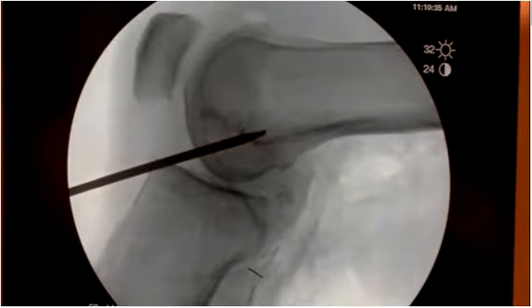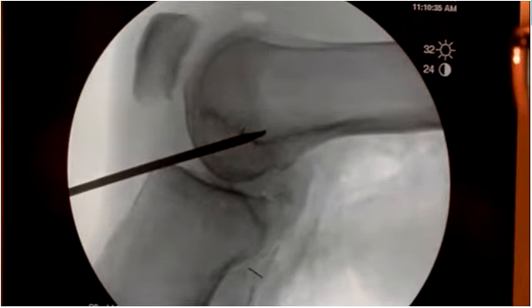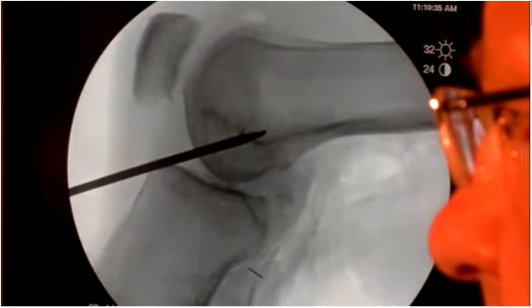Okay. So now superficial MCL. We have one question here. Yeah, the question is if you put a K-wire in and you're looking for isometry, how often is it off when you have that point that you've chosen right there?